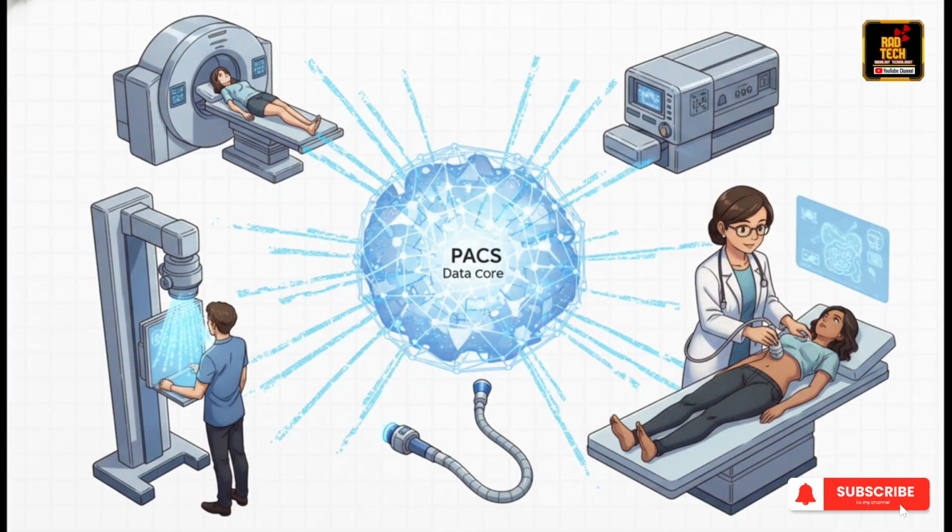Now, when we say acquire, what are we actually talking about? We're talking about the imaging modalities, which is just the fancy technical term for the machines that create the scans. This is everything from those massive CT and MRI scanners to digital X-ray machines, the wands they use for ultrasounds, and even those tiny little cameras from an endoscopy. They're all sources feeding new books into our digital library.